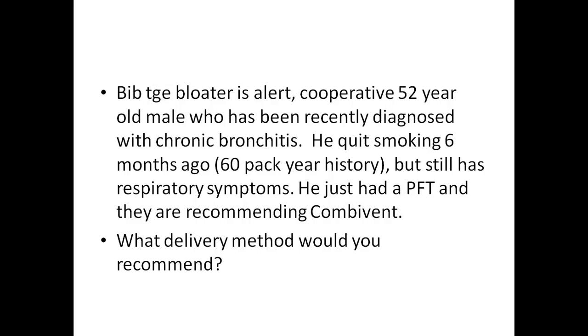In this case, for this patient, he's alert, he's cooperative, he's 52 years old. He's going to be able to most likely perform an MDI adequately. We may want to include a spacer or holding chamber. We'd want him to be able to demonstrate proper technique using the MDI.